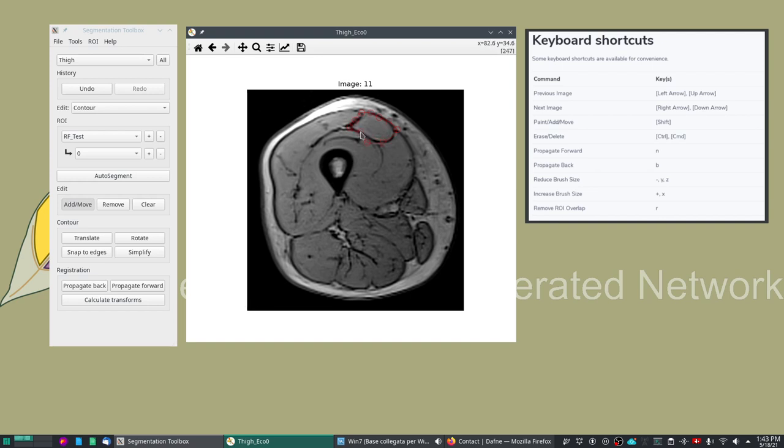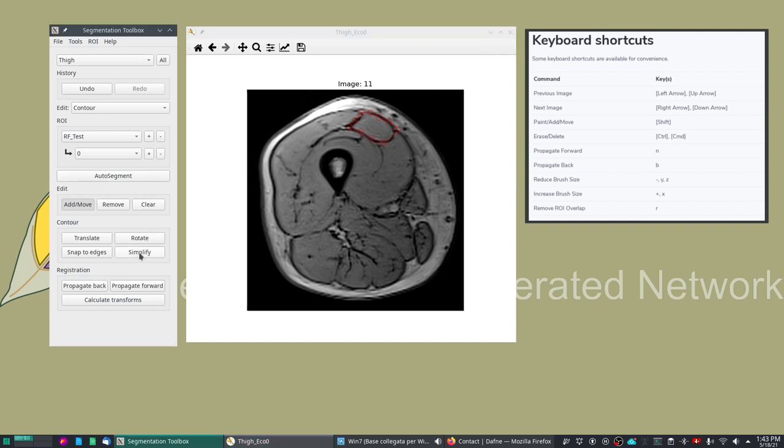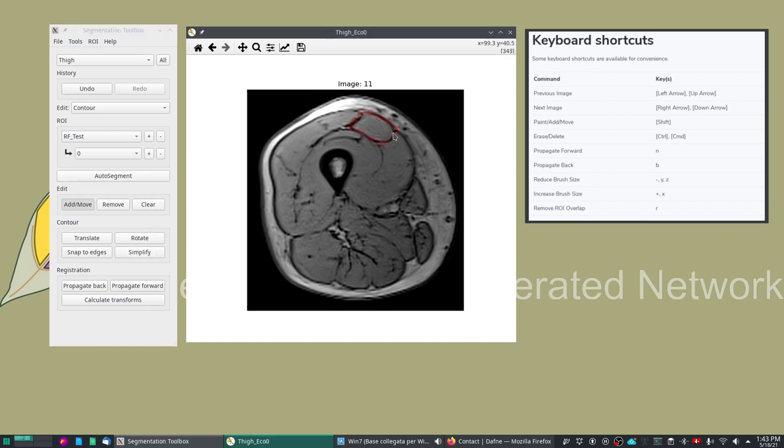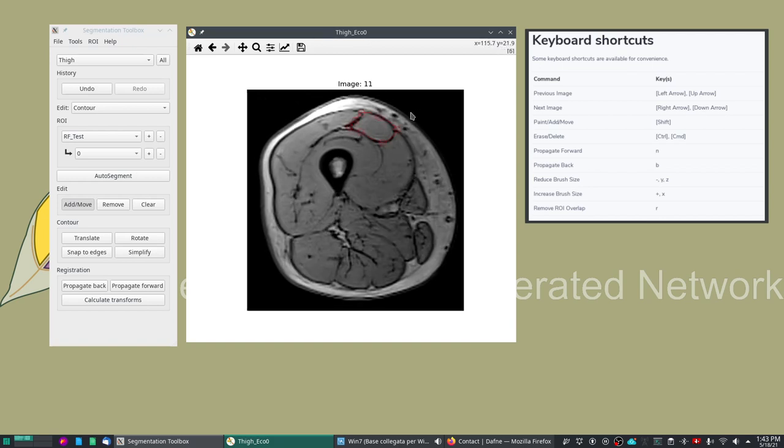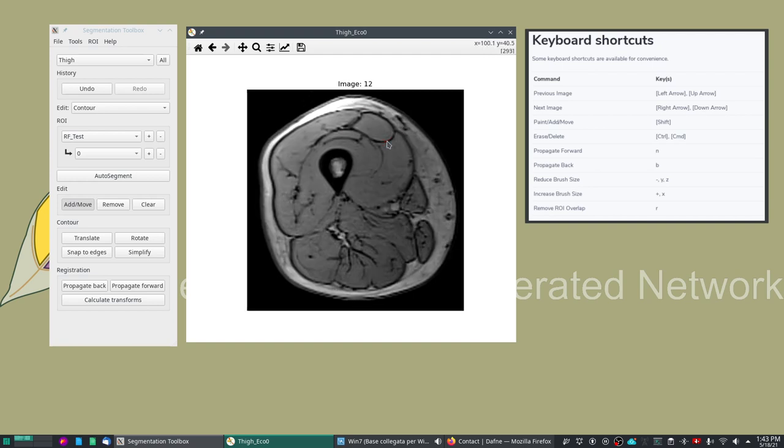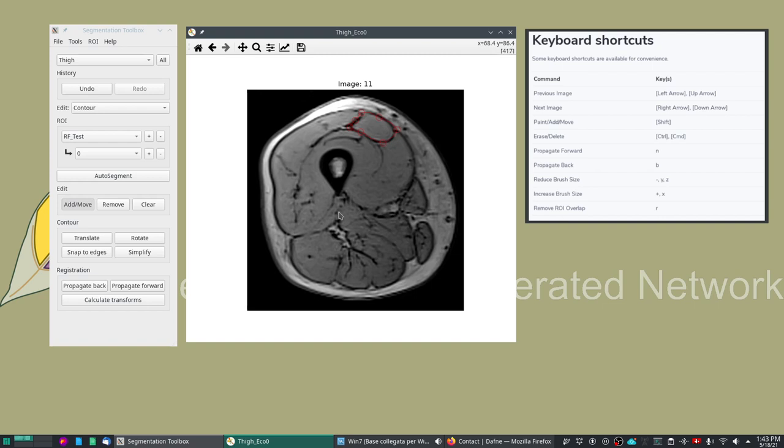There is also a simplify feature in case we have redundant knots. For example, let's add a few knots like this. If we click simplify then we have removed some knots. Sometimes the interface gets a bit stuck so you can go one slice above and one slice below and it will go back to its initial stage.